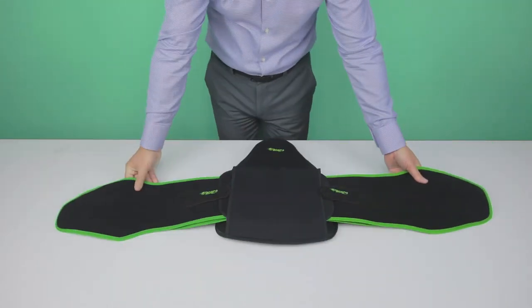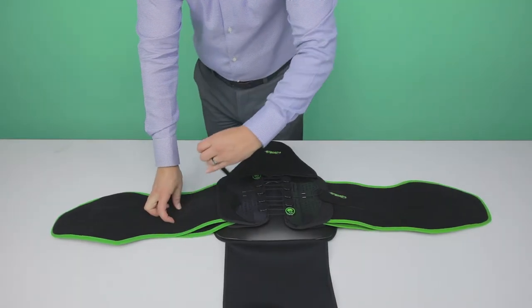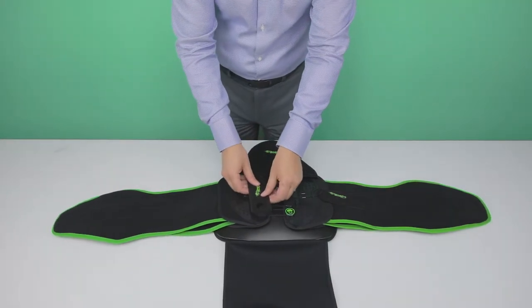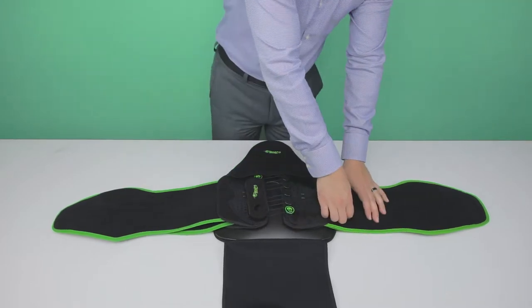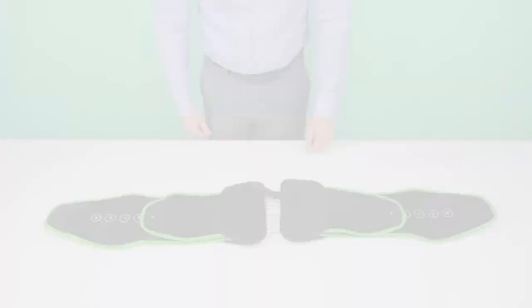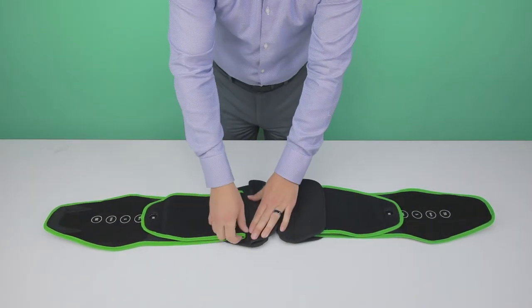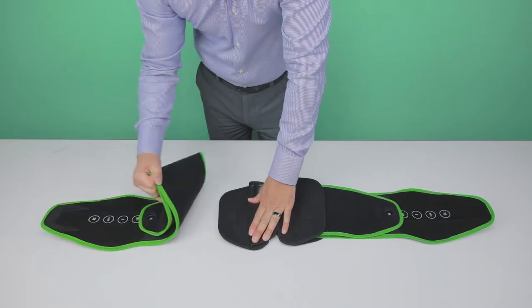Turn over and detach the back cover from the rigid posterior panel and place the pull handles over the round loop circles. Turn over and remove the plastic panel from the elastic band. Detach right and left soft panels by opening the center clamps on each side of the brace.